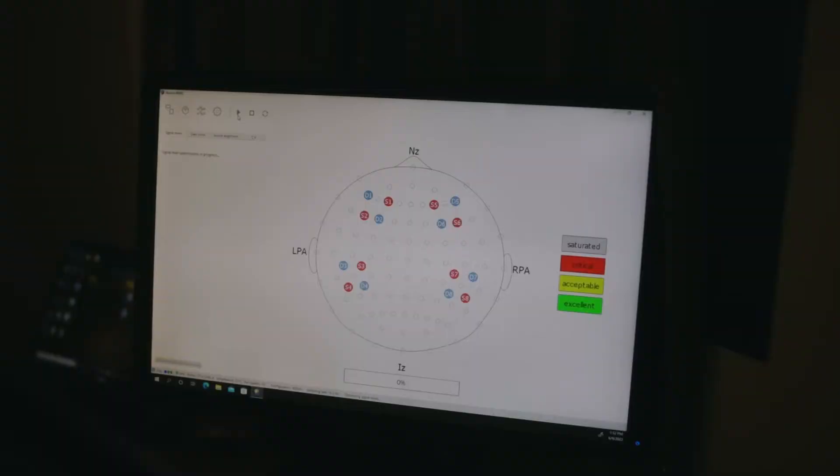Now she is checking the signal by running the signal optimization. When this window pops up she's going to hit continue and let it load — this is going to tell us if the signal is ready for data collection. Any channel that is green is an excellent signal, acceptable signal will be yellow, and critical signal will be red.